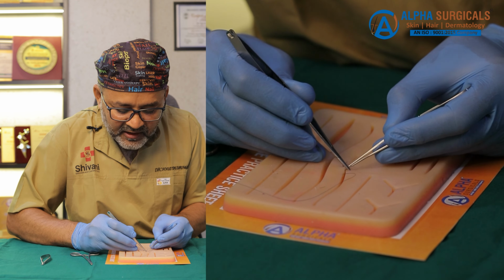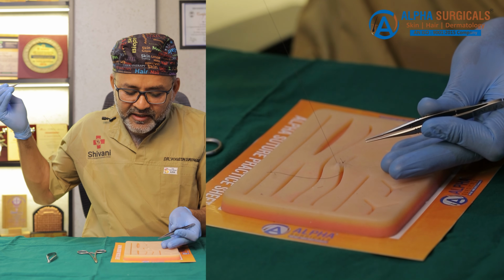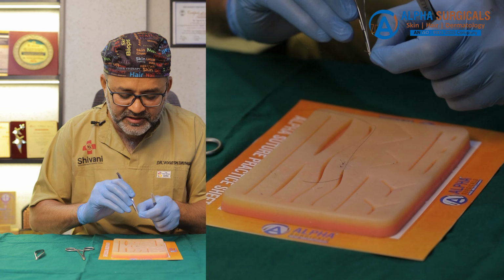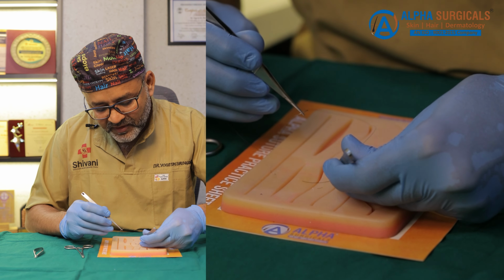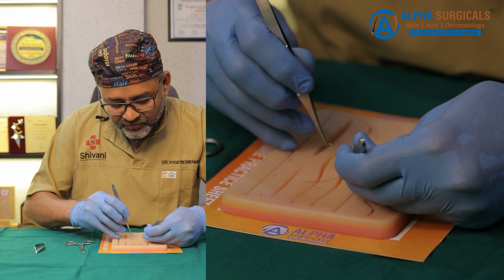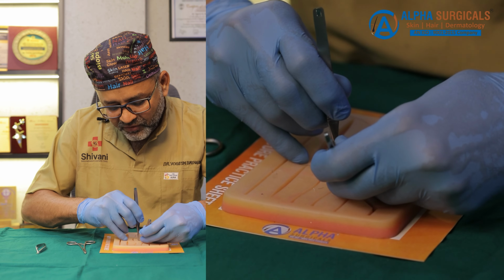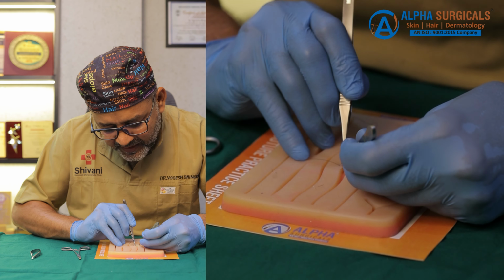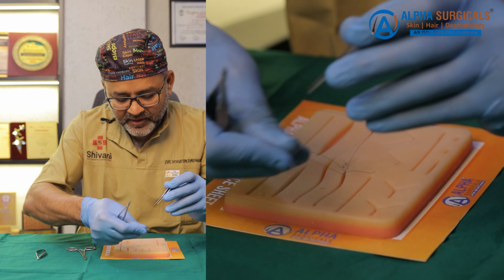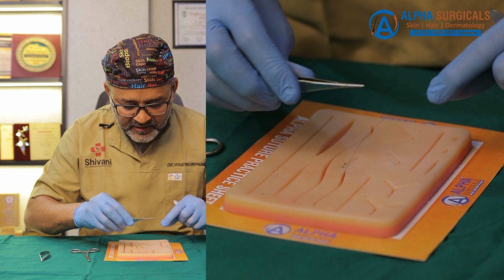So taking the needle out, and in the same volume and same depth from the surface, I will be taking the bite on the opposite side of the wound. So holding the left side of the wound margin, taking the bite at the same level and same volume, and this is the exit of the needle.